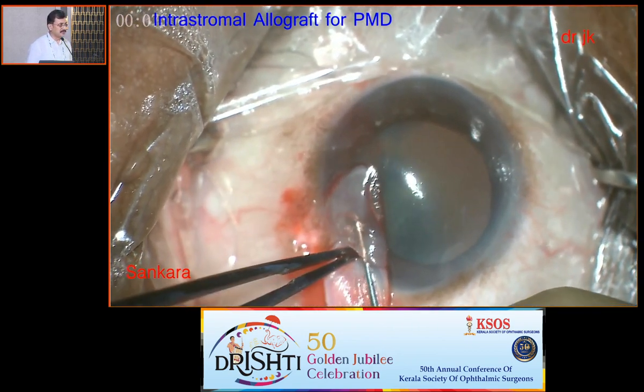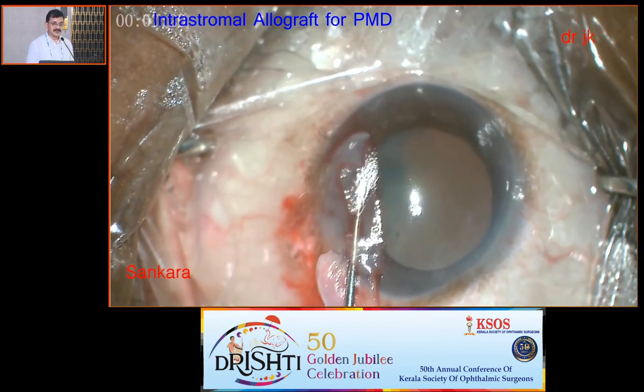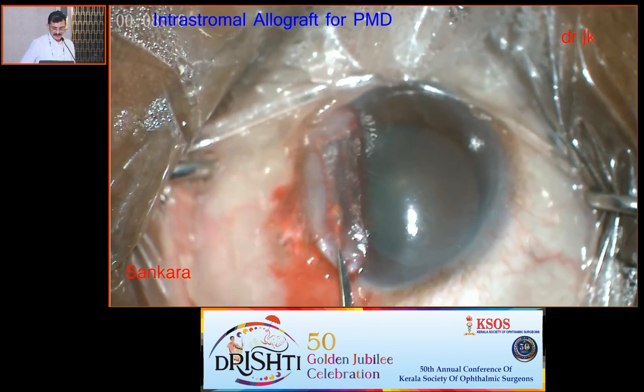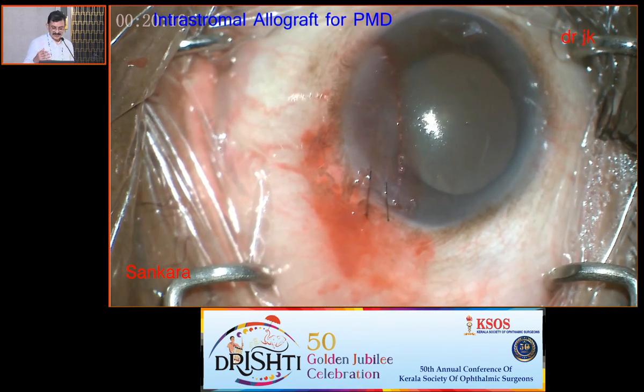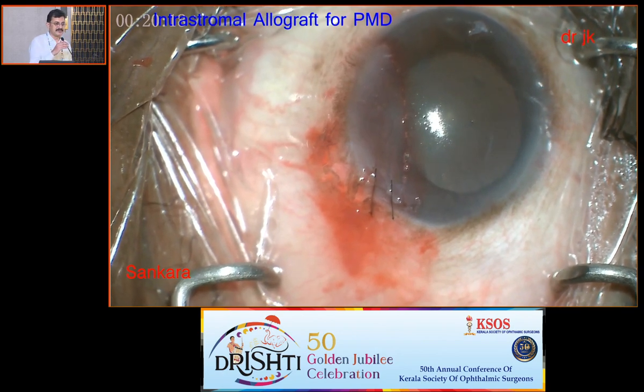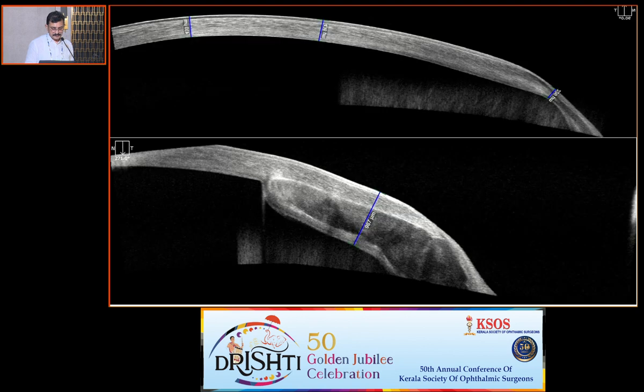Don't let PMD become worse. Once you diagnose PMD, you try to do it. You do it, it will work. Don't worry about that. So you put a lenticule there because it's not involved in the visual axis. There won't be dramatic flattening of the cornea. There will be a little bit, but you are stopping the disease process there.